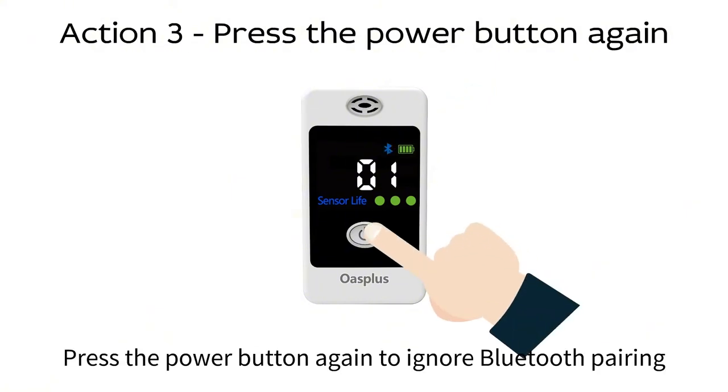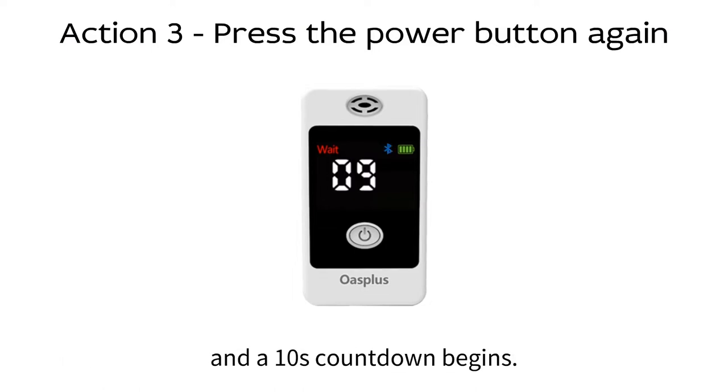Number three, press the power button again to ignore the Bluetooth pairing and a 10-second countdown begins.